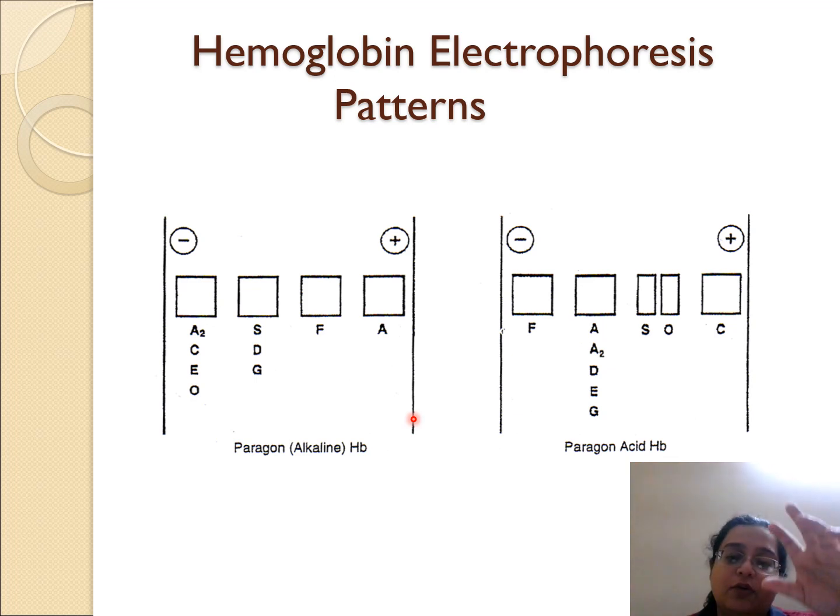You can just say, okay, it is eluting in this position, X position. So these are the probabilities, correlate clinically. HPLC eased this thing up a bit, but even in HPLC there are still a few bands which elute at the same position. For that, you need to remember what bands elute at the same position in the electrophoresis.